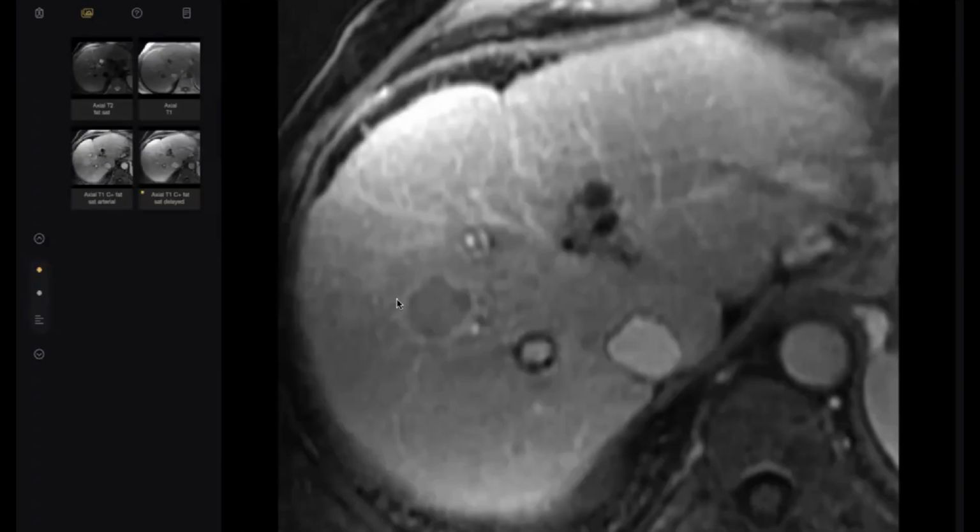In my opinion, after all of you have cleared FRCR, LI-RADS is the most important radiological classification because it is highly able to differentiate HCC, malignant from benign. If you apply most of the criteria of LI-RADS in any hepatic focal lesion in a high-risk patient, I think your diagnosis will be more than 90% accurate. But take care, LI-RADS classification only applies to high-risk patients.